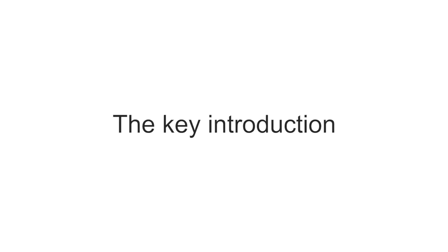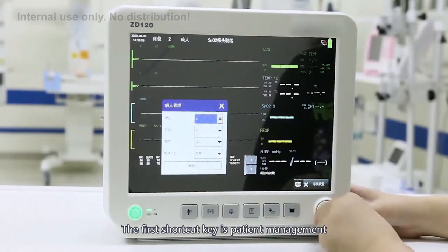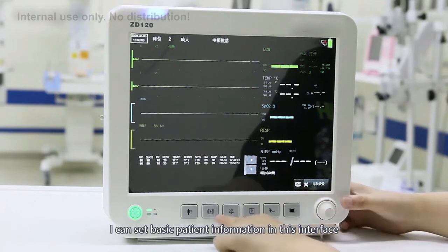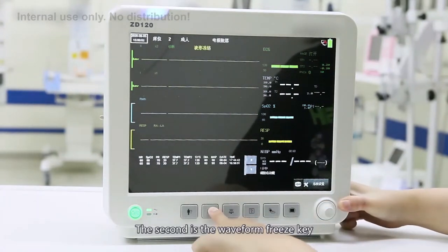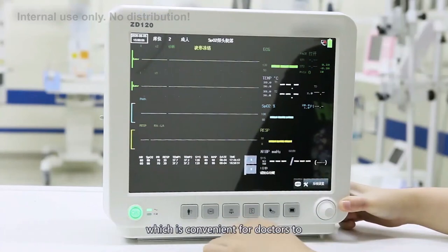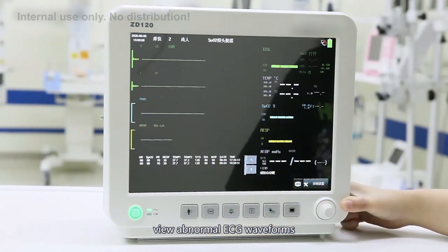Key introduction. The first shortcut key is patient management, where you can set basic patient information. The second is the waveform freeze key. A short press will freeze the measured ECG waveform, which is convenient for doctors to review abnormal ECG waveforms.